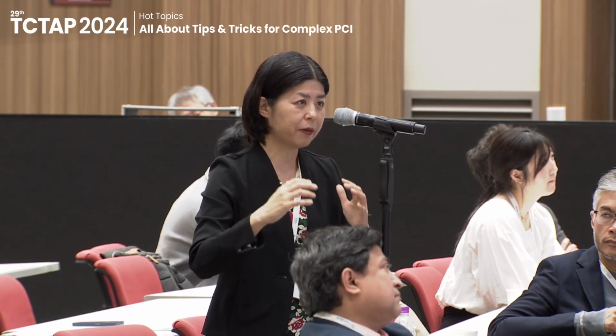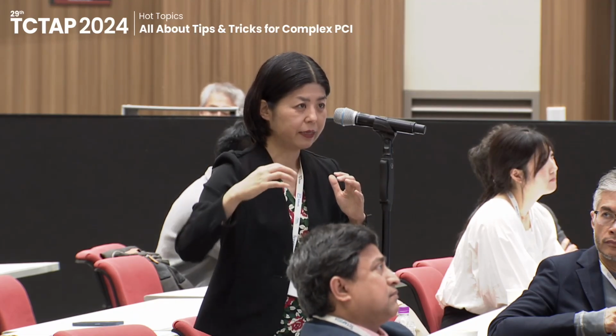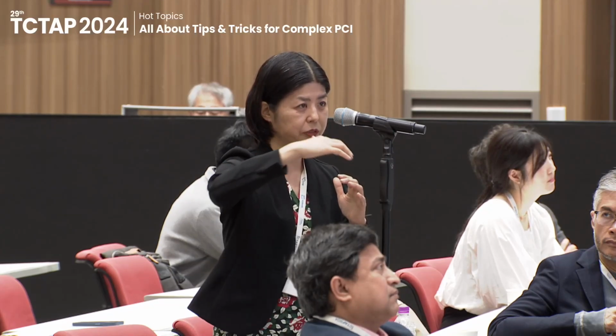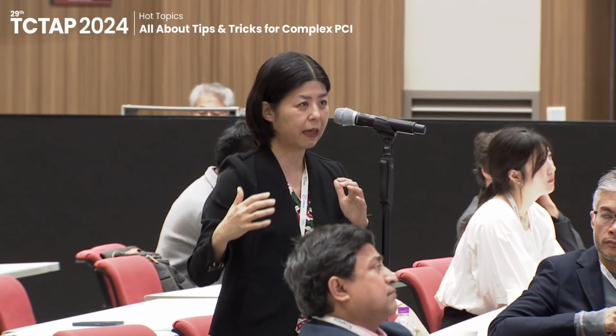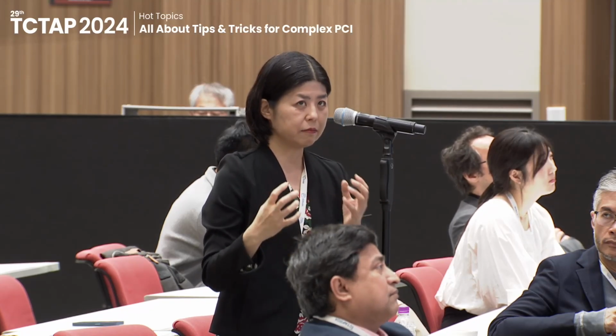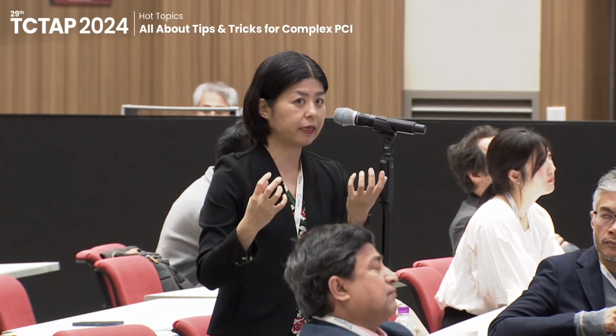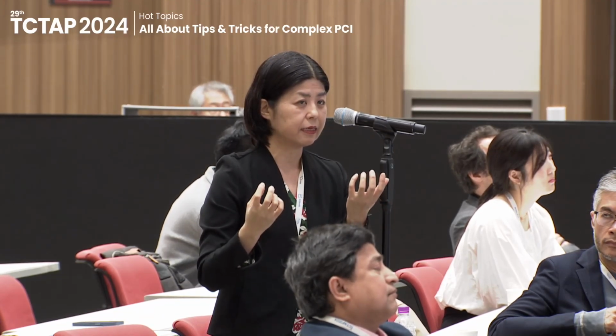And then because this is part of the fibrous cap rupture, there should be the thrombus on the top, and then the healing process similar to the healed plaque, and then we see the cap on the top. That's, I think, the major difference. And the non-eruptive one seems to be old, and the outcome after the device treatment is quite different.